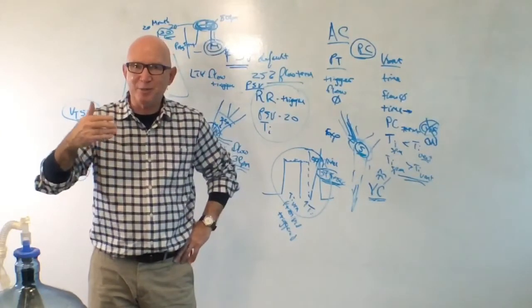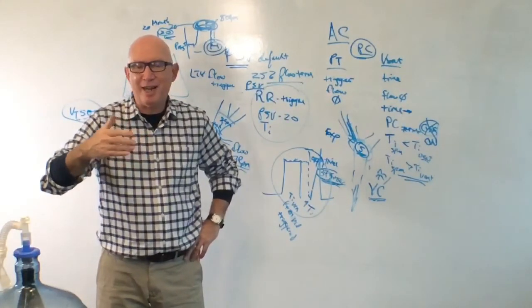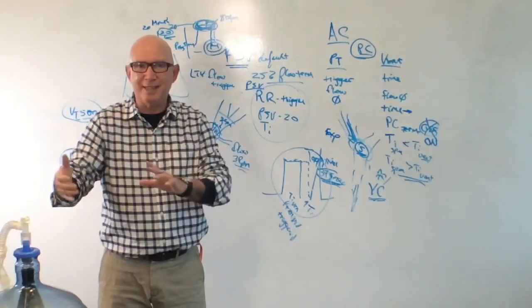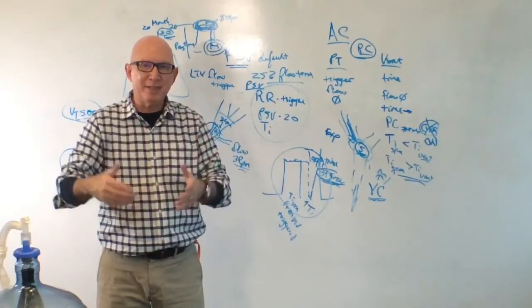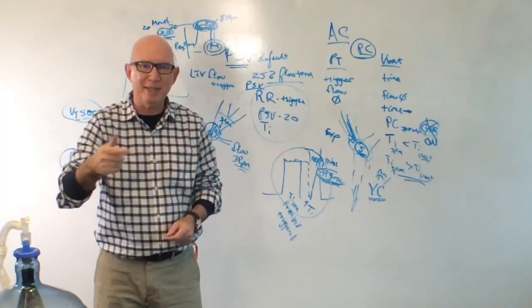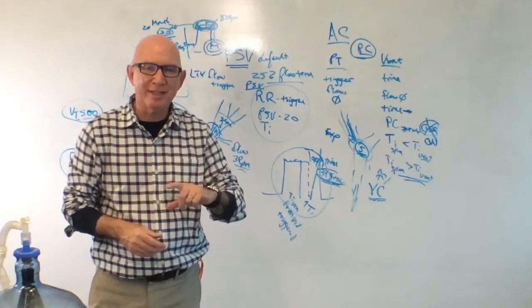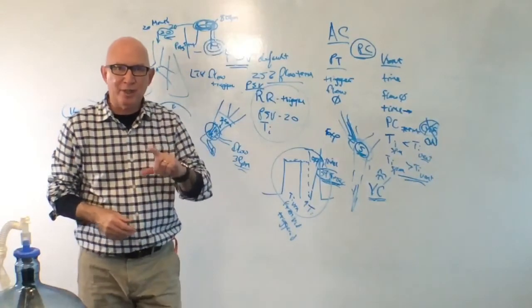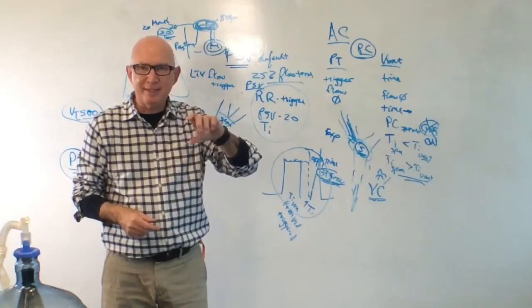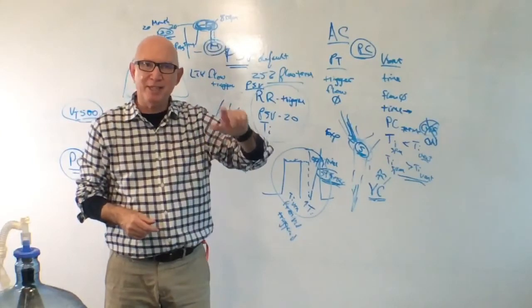And I'm not suggesting that we change our practice, but I'm also not suggesting that I wouldn't necessarily do that if it was myself. So it seems like it's a reasonable place to land. But we have 6 to 8 mLs to maneuver as long as it's with your ideal body weight. Which brings me to another point when it comes to the chart audits that I'm doing. There are few charts where people actually record the ideal body weight. In asking some of your colleagues, people are saying, well, we're calculating it, and our tidal volumes are based on that.